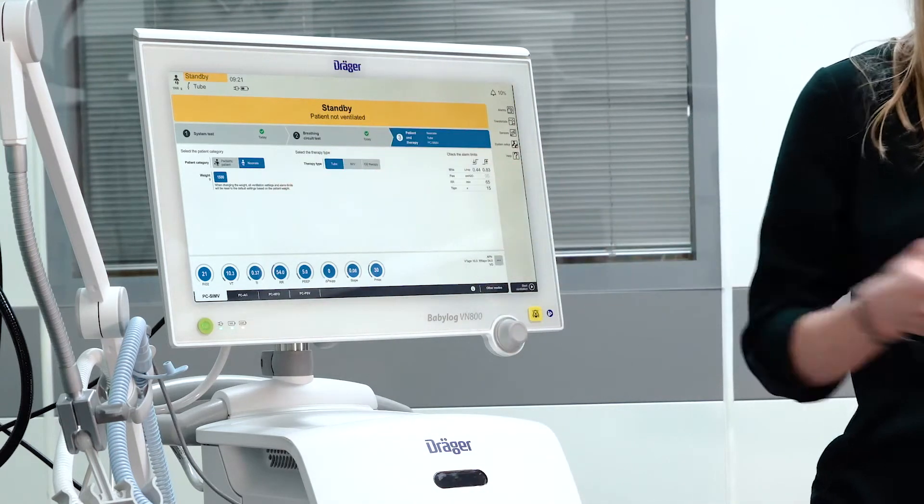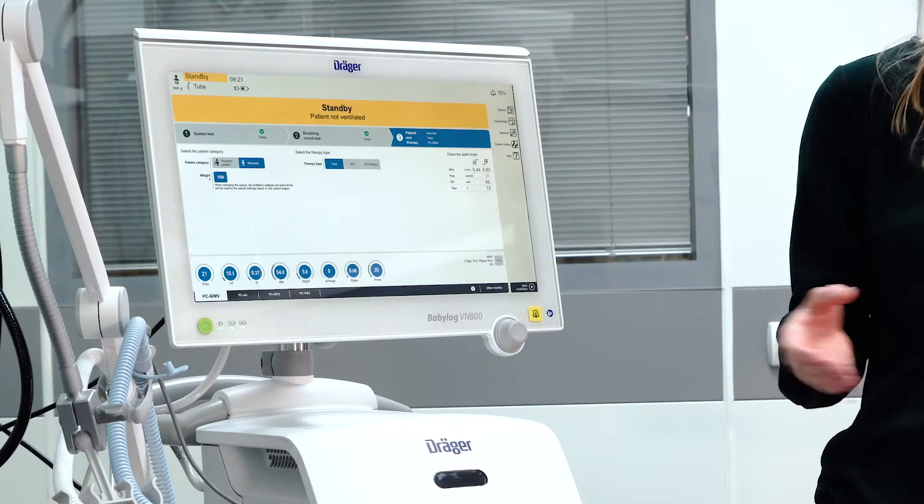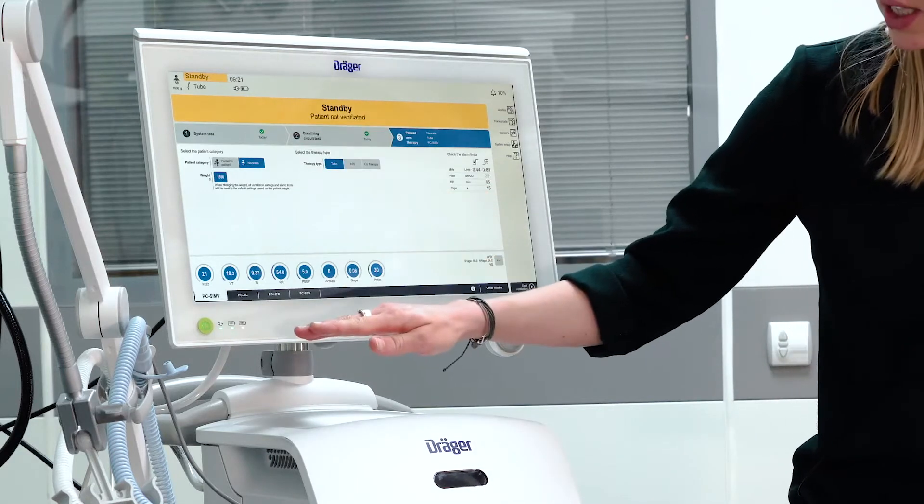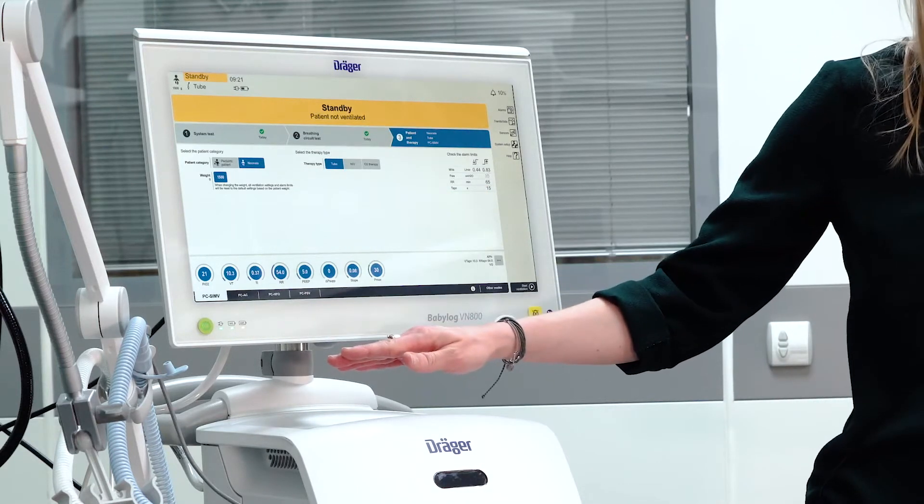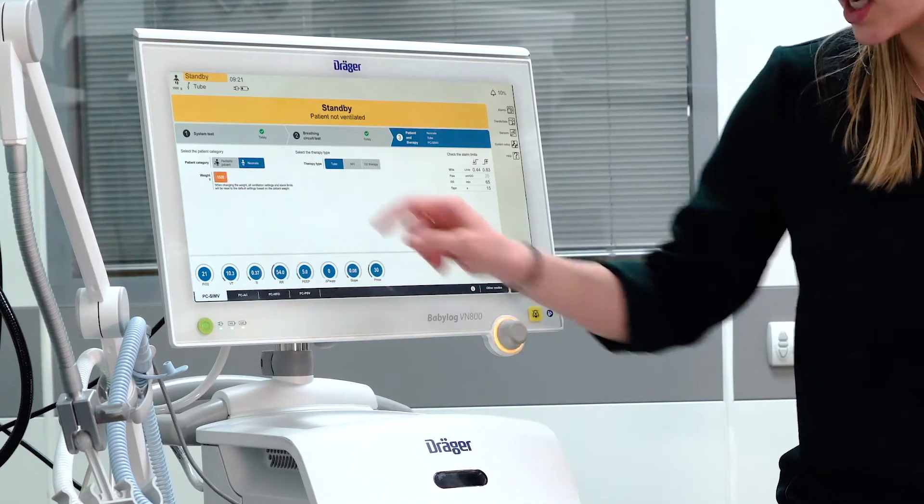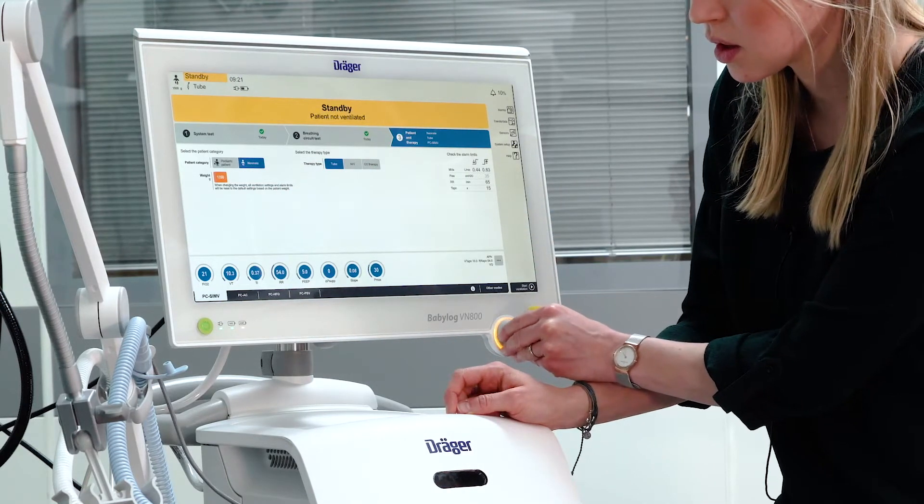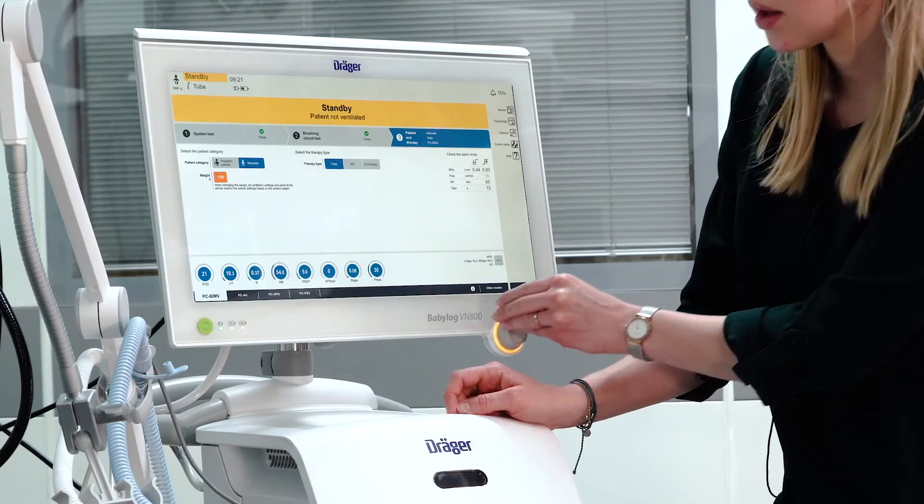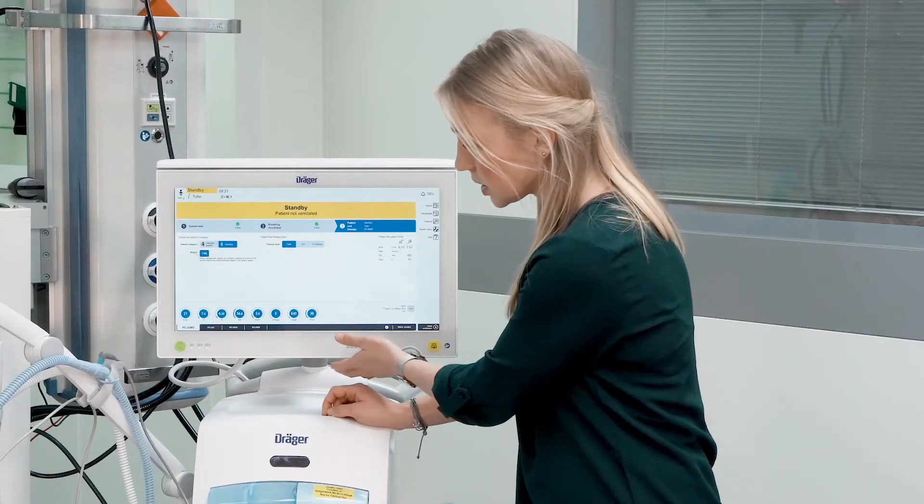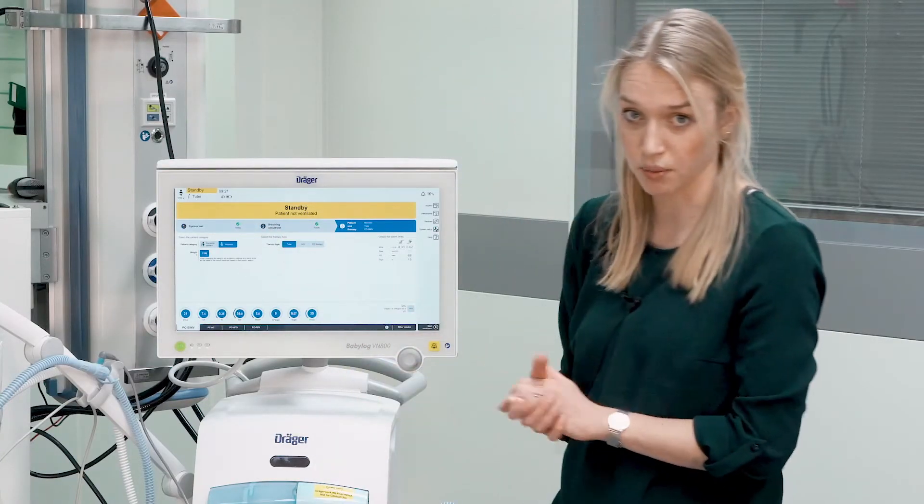If configured, you can choose to directly set the current body weight of the patient. The ventilator will start with a pre-configured ventilation mode. If you adjust this current body weight, the ventilation settings will adapt respectively to the body weight.